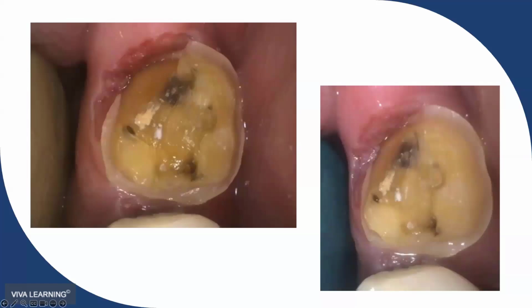So it's no problem on a class 2 to do a little polish up with your handpiece. I will often use a handpiece, because that analgesic effect carries on for 7, 8 minutes. So you have this open raw class two, and they're perfectly comfortable with me doing my bonding steps, right? Air, water, dry it, put the bond on, adapt the flowable, whatever you're going to do, they're totally fine.